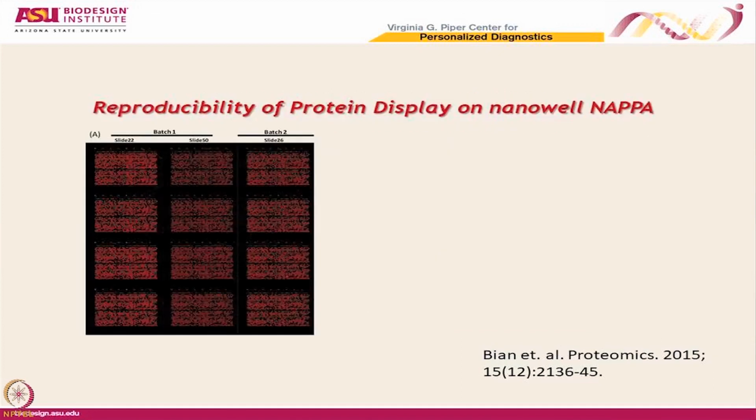So in our lab right now, this is probably the most sensitive platform we have for detecting interactions. This is just to kind of assure you that we can print these arrays very reproducibly, because that's one of the things that you want to be able to do.